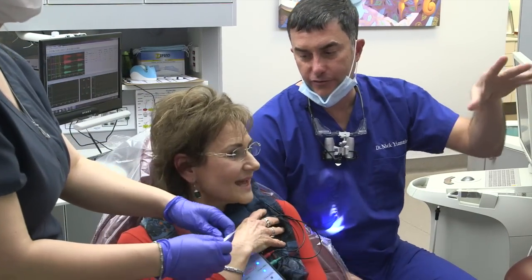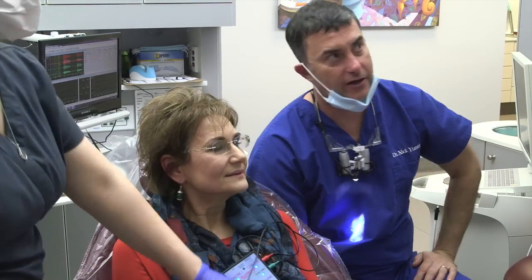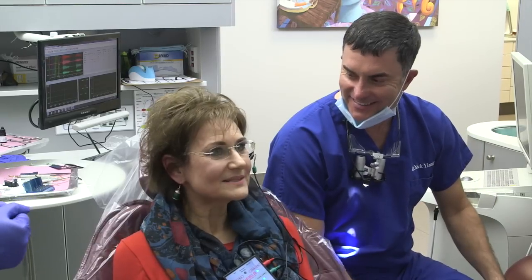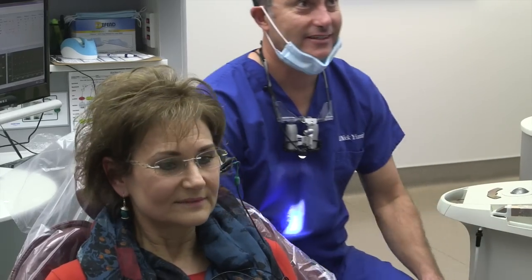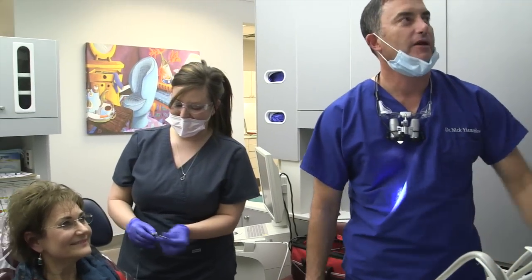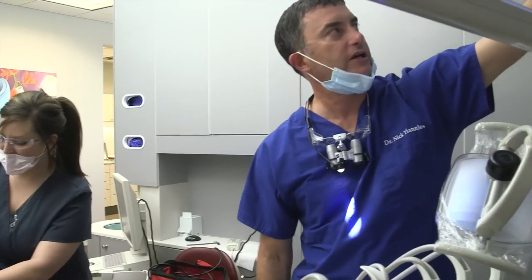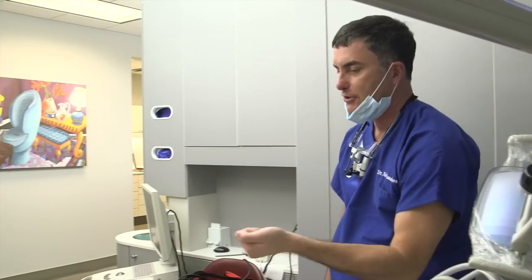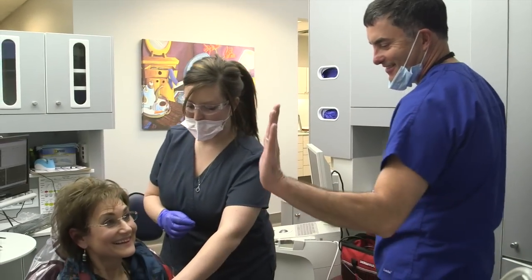Those muscles are in spasm right now — they don't know what to do, they're quivering. It's going to take a little bit of time for them to get used to it. It's been tense for so long. It's documented — 4.9 microvolts; it should be below 2. He's double what he should be right now, because the muscles are just firing. If I put this on you next week, it'll be back to baseline — probably below, actually. It'll be super efficient, like putting a chip in your car and getting 40 miles per gallon instead of 20.